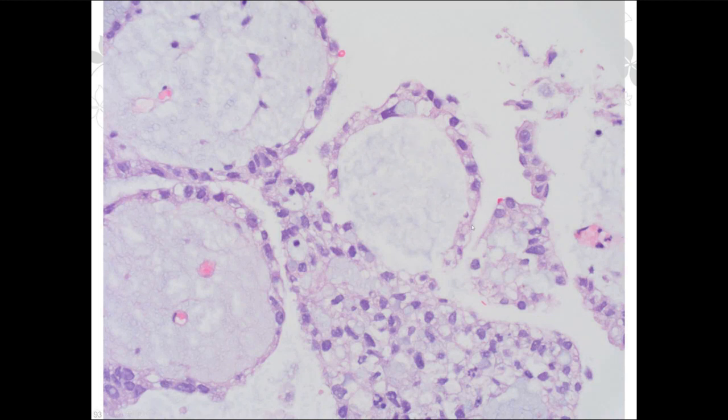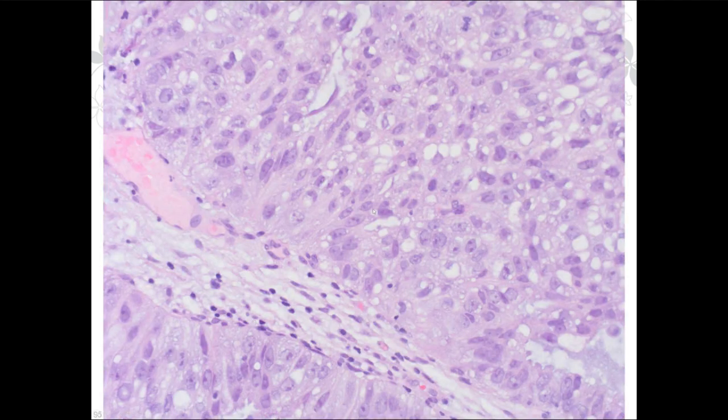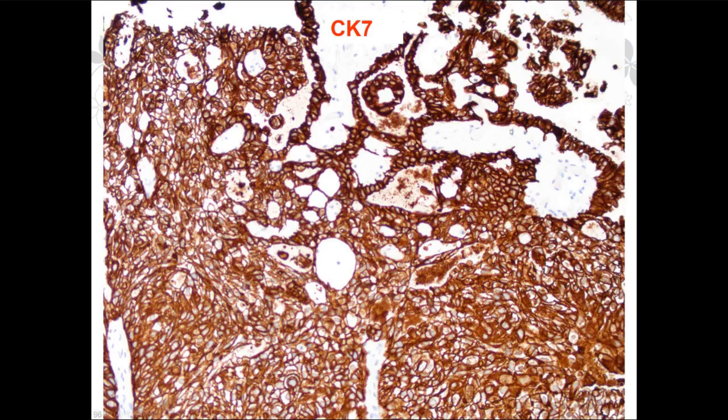At higher power, you can see single lining, which is more cuboidal looking. You can see some mucinous or mucoid stroma. And at higher power, you can see more large pleomorphic nuclei, some large cytoplasm, and very solid growth pattern. Some of these nuclei have prominent nucleoli.